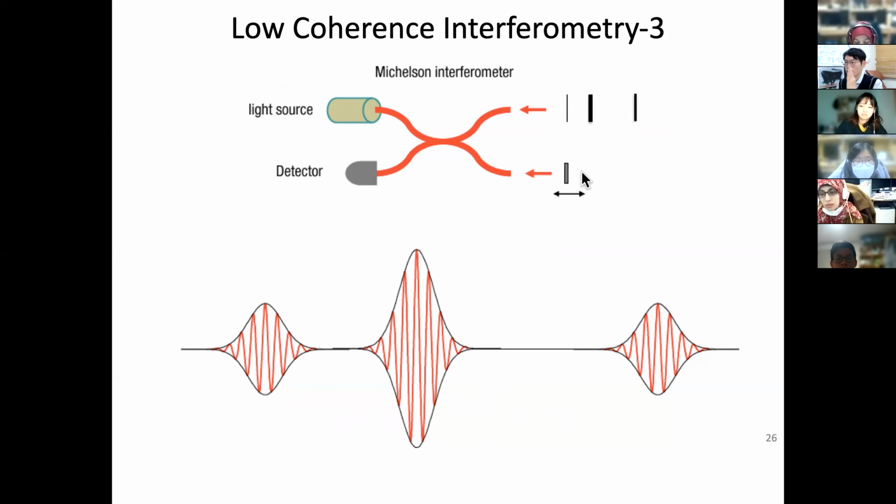Now you move further down, and you lose this one because it's beyond the coherence length. Now you are close to here, and then you have a huge interference because there's a huge reflectance here. Then you reach here, and you forget about the other because it's not phase relevant. You only deal with this similar part.